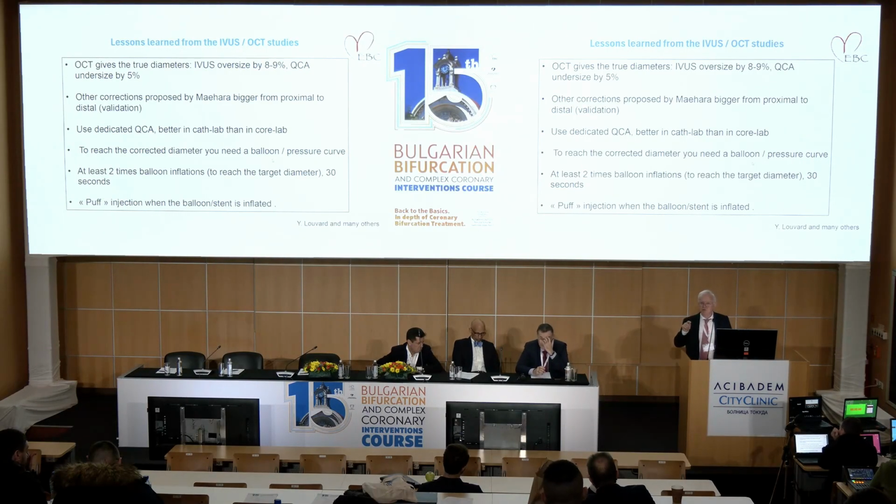Now, you have to put the balloon and the stent at the diameter you measured. Going to 24 atmospheres immediately without thinking is wrong. Inflating for 10 seconds, what we hear in the meeting, they say on, and 5 seconds later we hear the click. This is also nothing. So you have to take into account the pressure-diameter curve that you find in the box of the stent company.